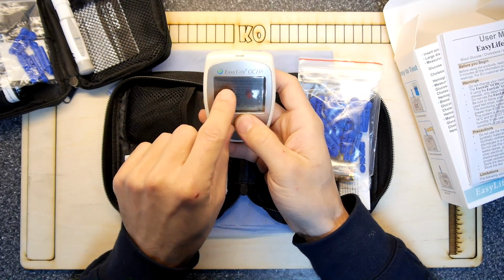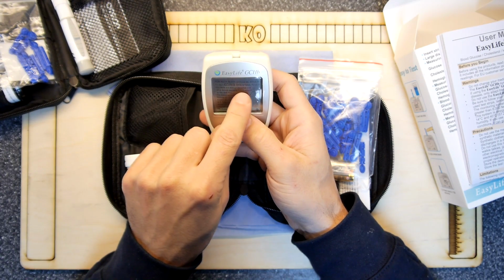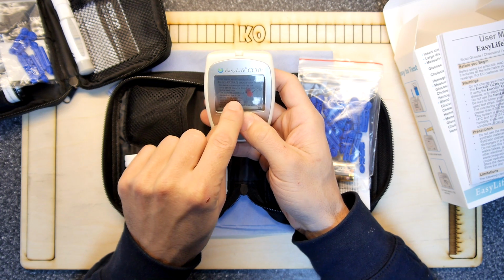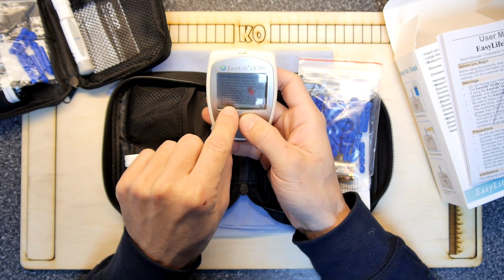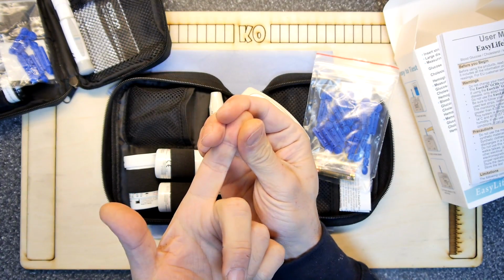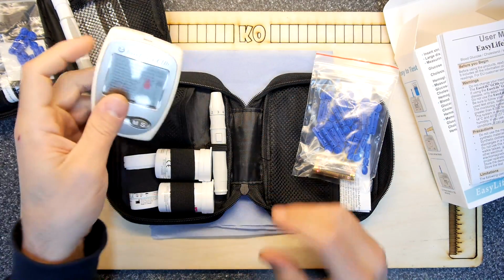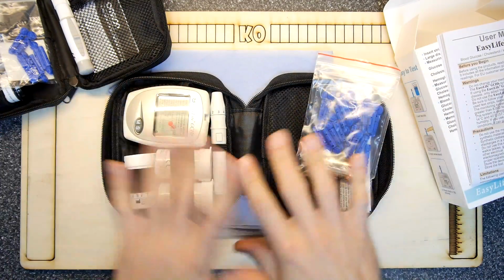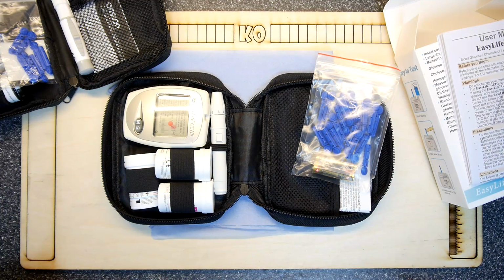How much blood should be applied to get an accurate cholesterol result? Squeeze out enough blood at one time before applying blood sample to test strip. The round-shaped blood formed on the finger should be at least 15 microlitres or half a centimetre diameter. Hold the finger to the test strip until the meter beeps. That's like a really massive one. You're going to be really pushing that one out. So what I think I'll do, I'll stop the camera right there, go through this, set it all up, put the batteries in, make sure it's running, and then we'll open the vials and have a test with something.